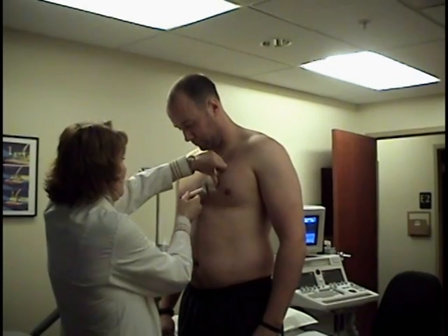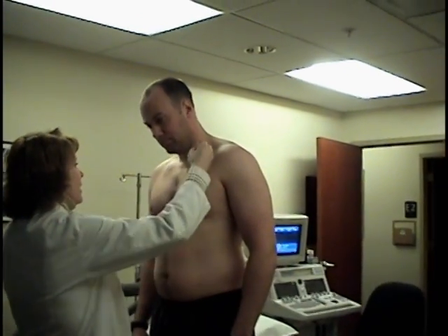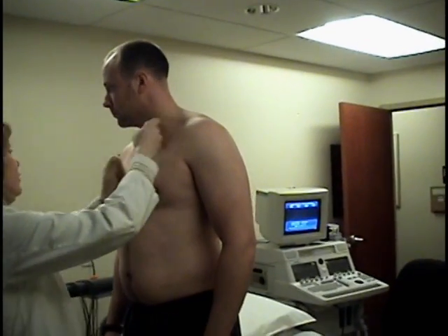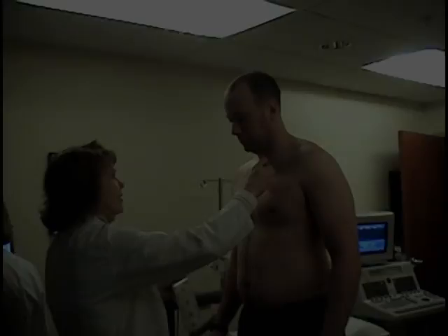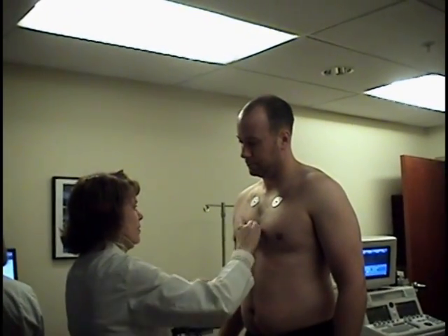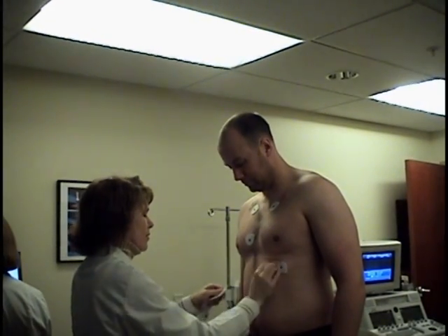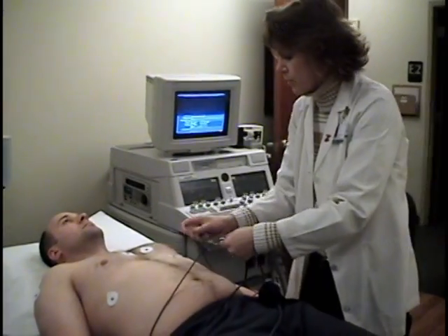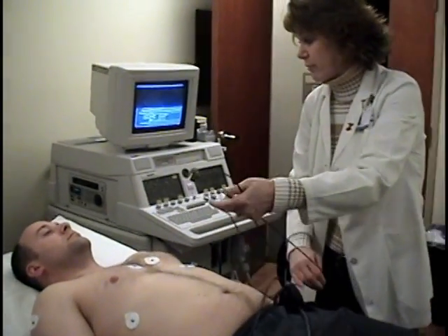If you are a male patient, it may be necessary to shave a portion of your chest. This ensures the proper connectivity of the electrodes. Once the electrodes are in place, we will record your baseline EKG.